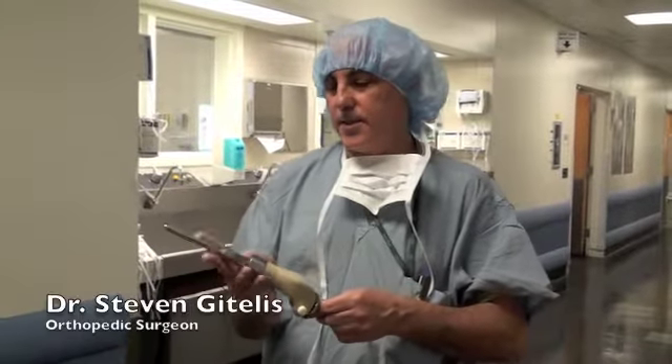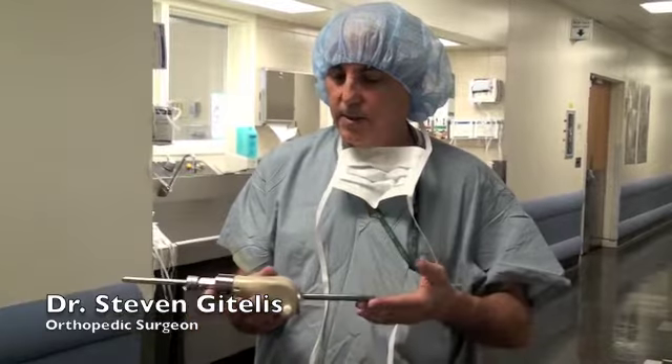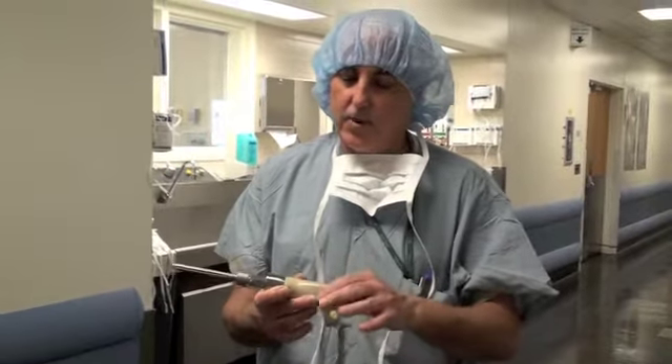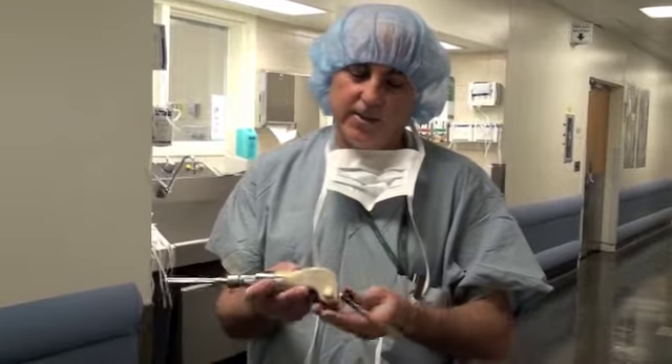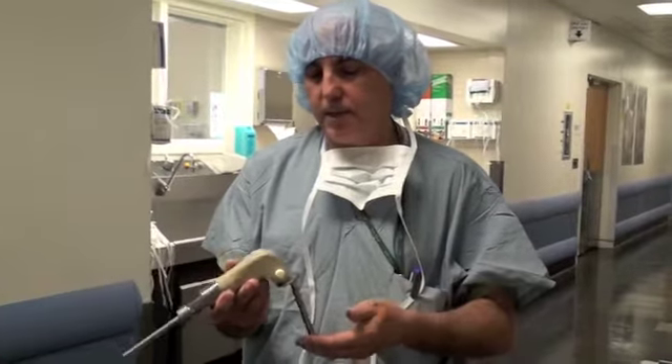This is a pediatric prosthesis for bone cancer. You can see it acts like a knee joint — it bends and extends. What's unique about it is that I can grow it, I can expand it without operating on the child by simply pressing a button, and this will lengthen, keeping up with his growth.